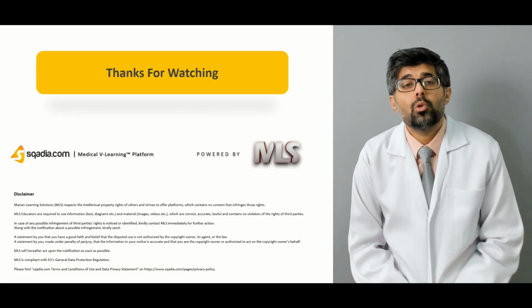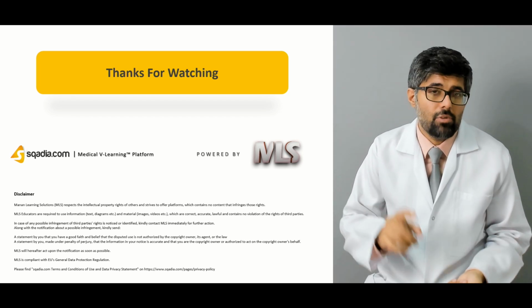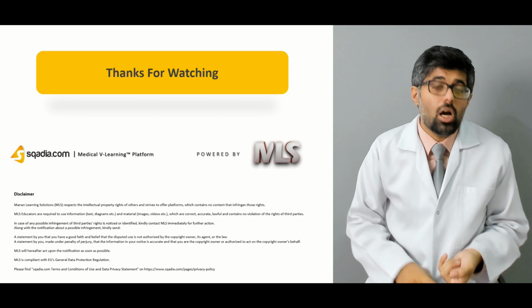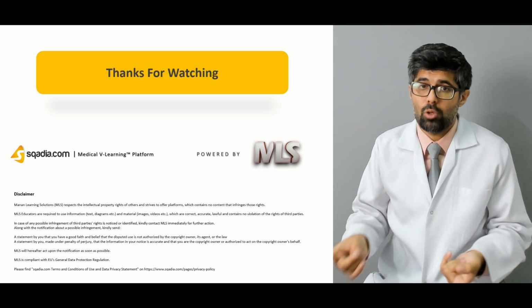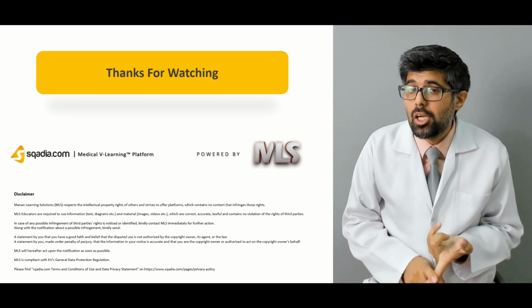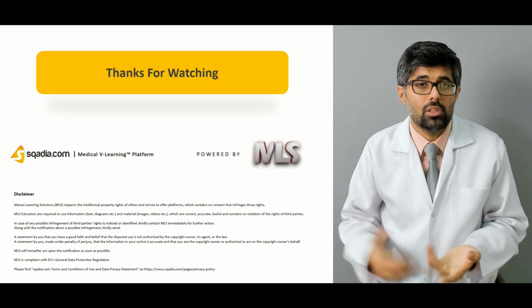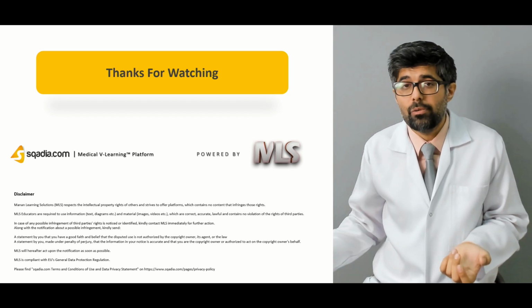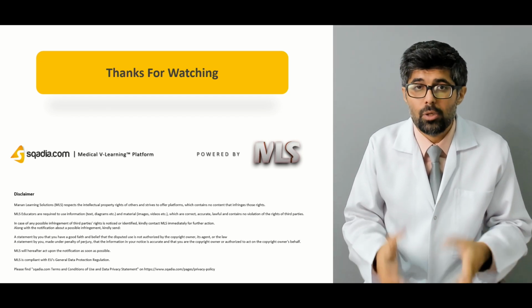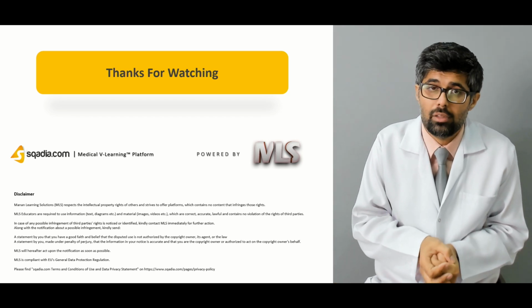So what we have learned today, we have learned about the introduction to chest radiology. We have learned about its fundamentals, how it's used, where it's used, how important it is in the career of doctors. Then we learned about the different modalities, the primary modality being the chest X-ray. Then we learned about its different projections, the AP, the PA view, the lateral view, and what makes these views correct and what makes them incorrect, because one has to identify which ones are correct and which ones are incorrect.